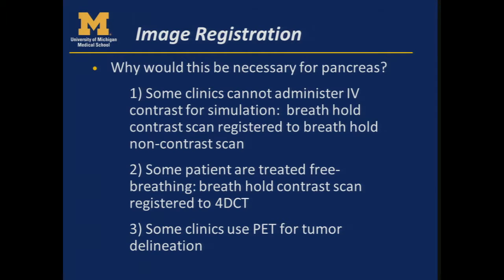And I do want to spend a little bit of time on image registration, because a lot of people don't think about image registration for pancreas cancer. So why would it even be necessary for pancreas cancer? I didn't think it actually was until recently. So many clinics I found out can't administer IV contrast for simulation. Apparently there are medical legal reasons about having plastics available for contrast extravasation and whatnot.